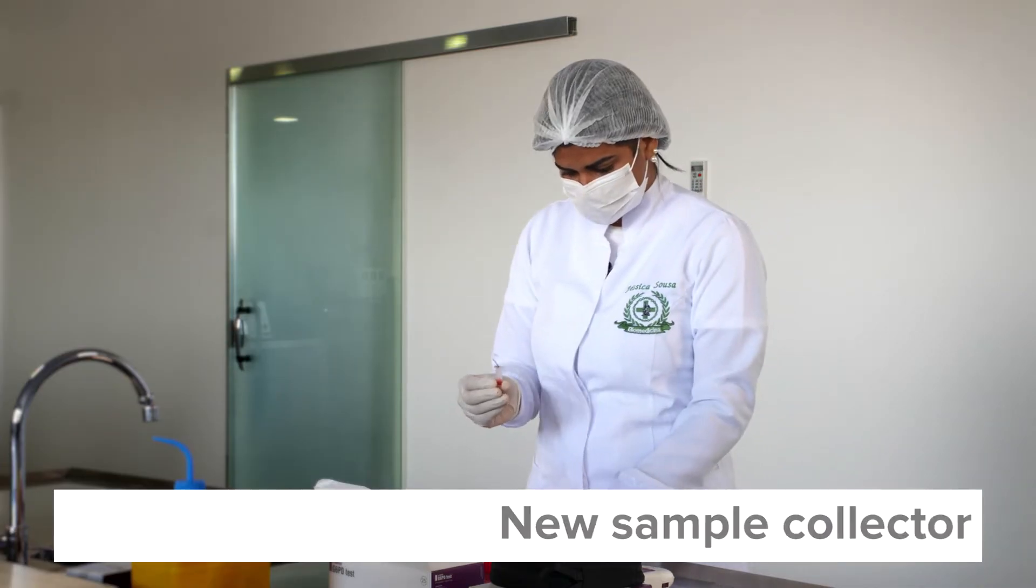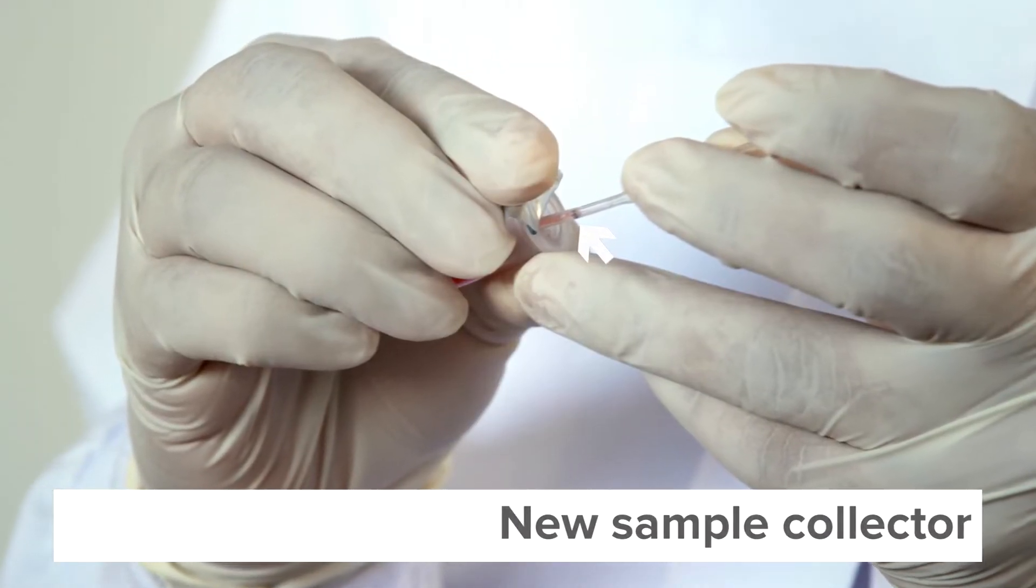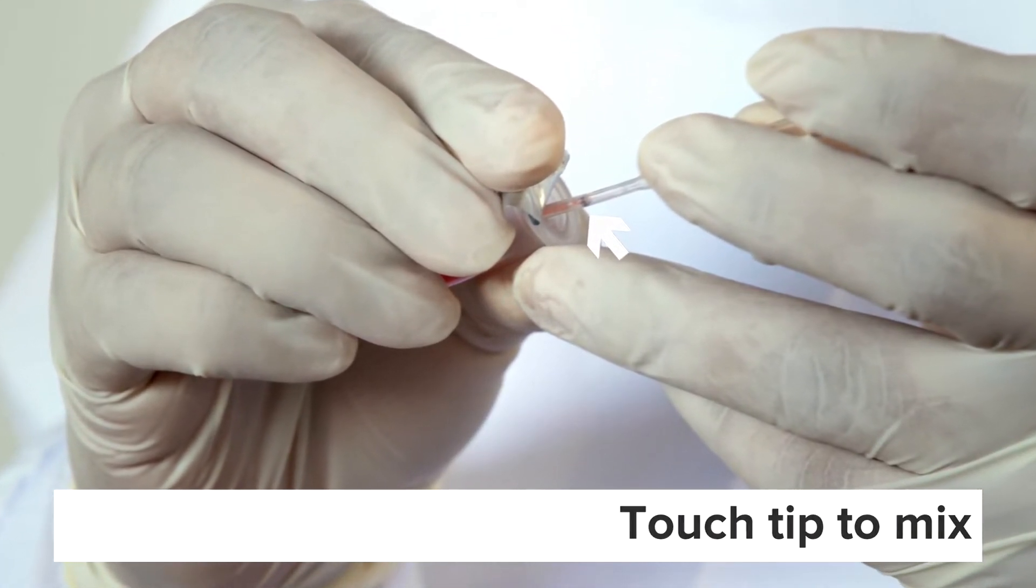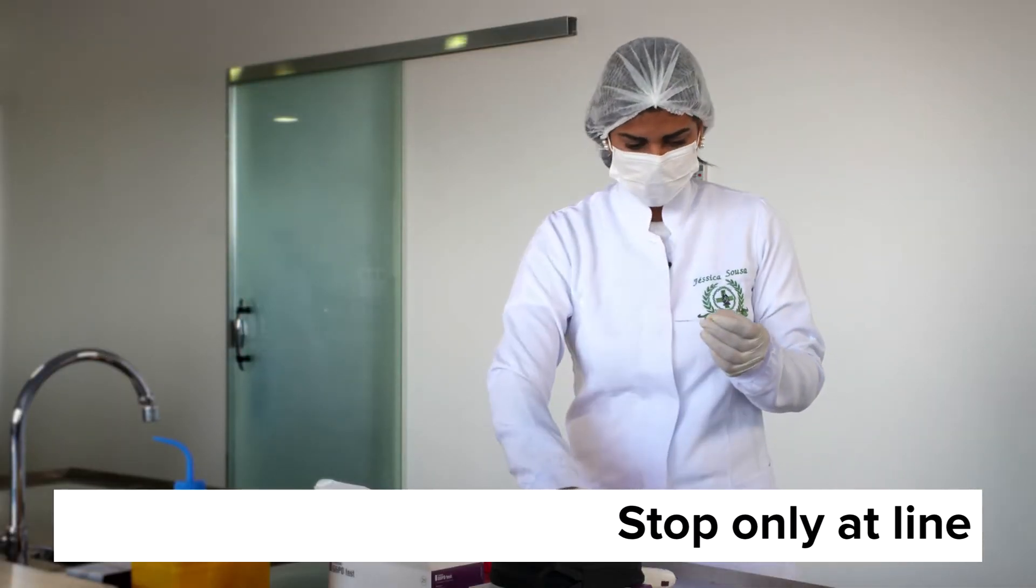Take a new sample collector, hold it by the stem at a 25 to 30 degree angle and touch the tip to the mixed specimen. It will automatically fill to the black line. Stop only when it reaches the line. It's important to get the right amount of mix.